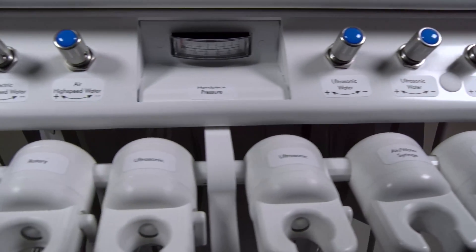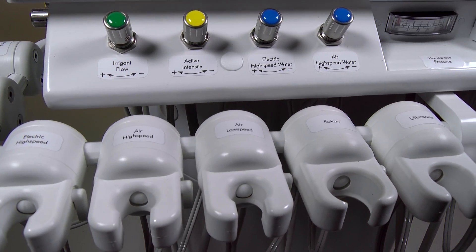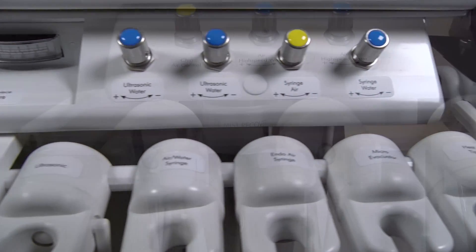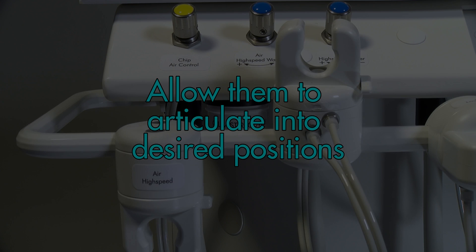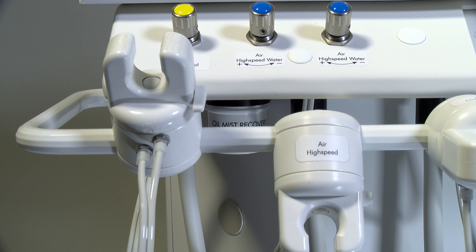ASI's handpiece holder design provides true-fit capability to provide an exact fit for the air and electric instruments. The holders feature robust capability with spring-loaded capability to allow them to articulate into desired positions from up and down, left to right, as well as the ability to slide along the bar for preferred placement.